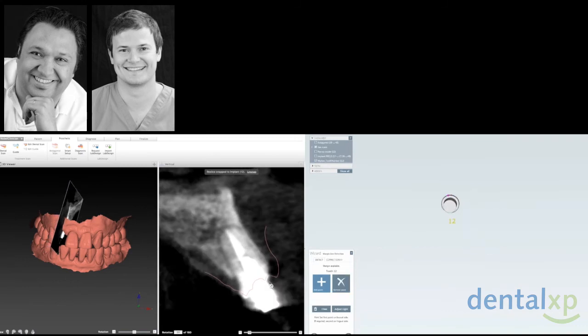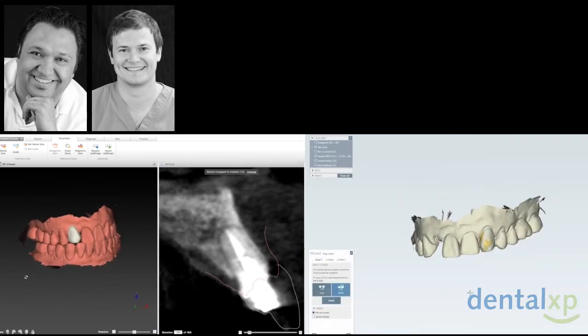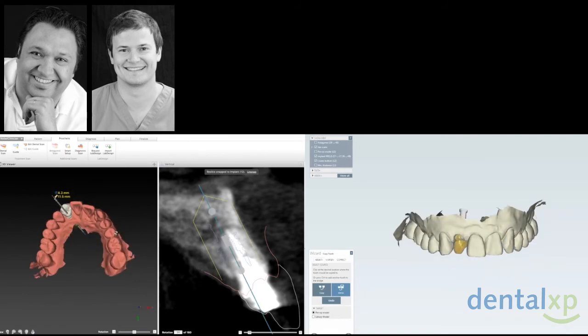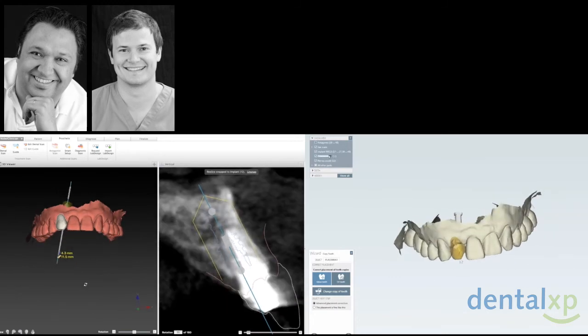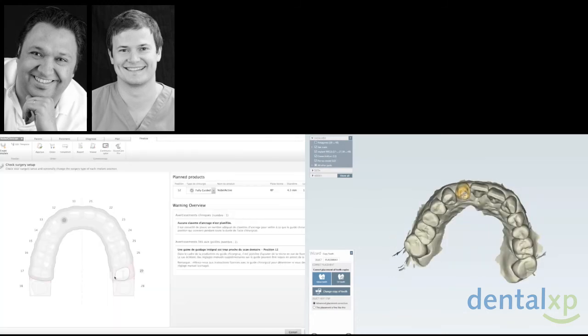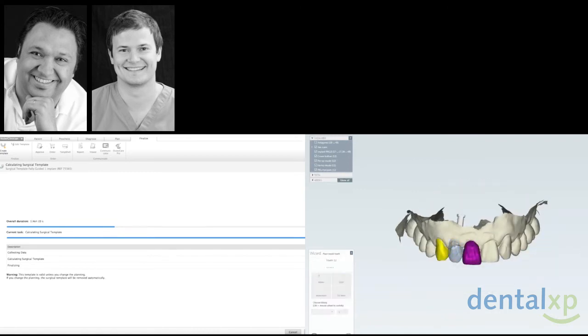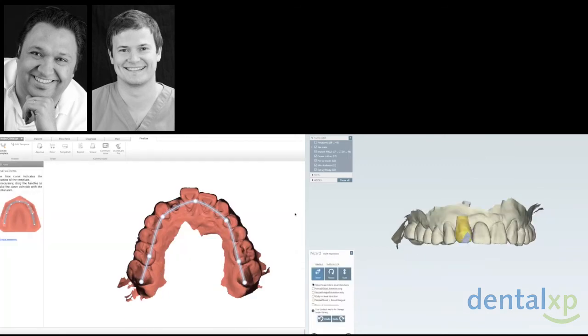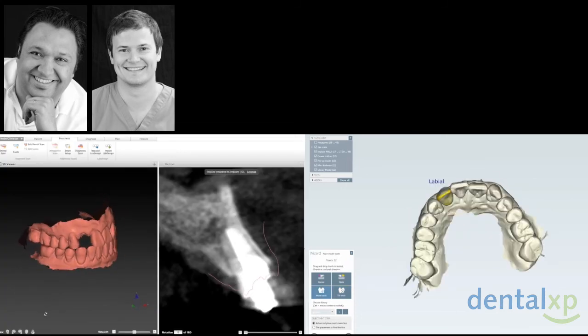We merged the STL file of the digital impression of your patient to its CBCT file. And in this case, we ask for a specific lab design. Instead of choosing the tooth in the library form, we ask for something that we call biocopy of the contralateral tooth. Biocopy is a really interesting feature because it allows you to copy the right shape, texture, surface of the tooth and to paste it on the surgical side. It's really an easy way to get a temp shell that will allow you very easily to get a natural result.